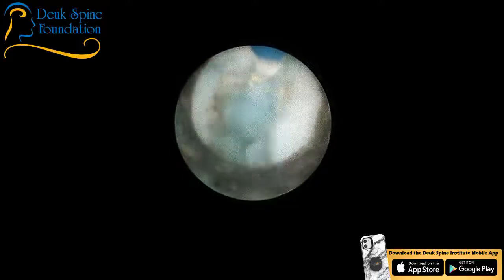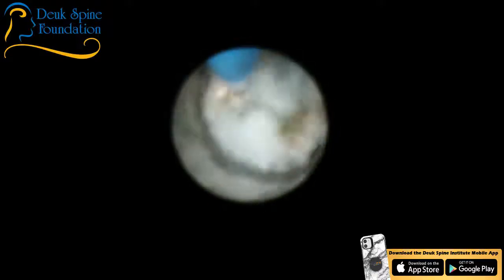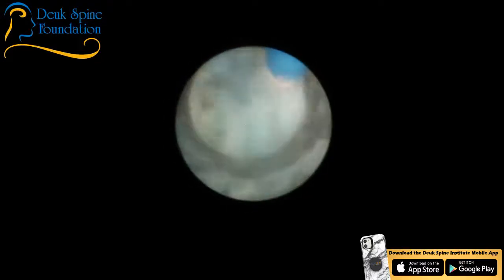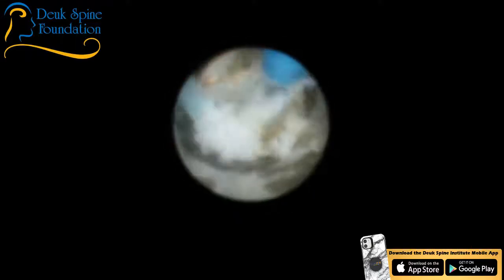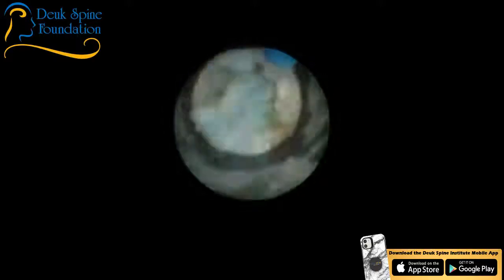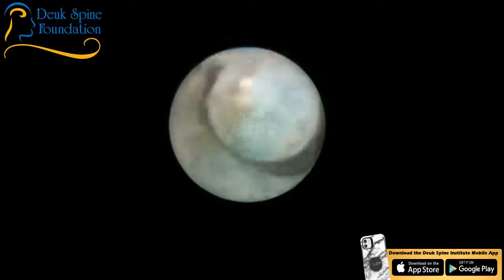Lots of different meanings of floaters, but here at Deuk Spine, a floater is a herniated fragment that is floating up to the surface so we can get it out. There's the annular tear, by the way, in case you're wondering, the white thing. Look at how beautiful that is. So this is all stuck down herniation, right at the back of the disc. This is what normally, if you're doing an anterior cervical fusion, you scrape out with a scraper. If you've ever watched one of my ACDFs, anterior cervical discectomy and fusion, you'll see me using a curette called a Codman curette. And I just scrape this stuff out in bulk.